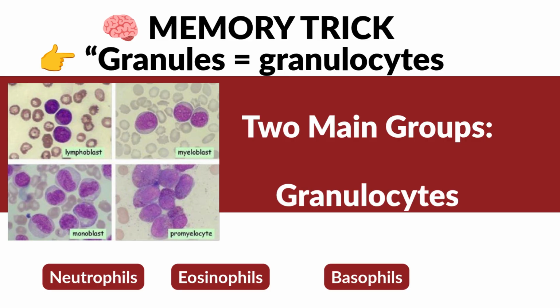Those are some things you should be looking out for when you're trying to answer some of these questions on the MLS. And which granulocyte is increasing? Do we have an uptick in neutrophils, an uptick in eosinophils, basophils, or anything like that? So, high yield granulocyte comparisons. I'm telling you all this now because we're going to keep reviewing as this slide goes, so bear with me.